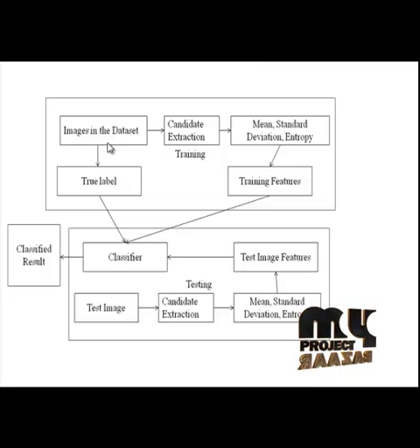Let me see the flow of the process of detection of abnormalities in retinal images. Initially, the test images are taken, and green channels from the images are extracted. The green channels extracted from the retinal image consist of the useful information related to the defects in the retinal images. So it is extracted. Then after that pre-processing is applied.